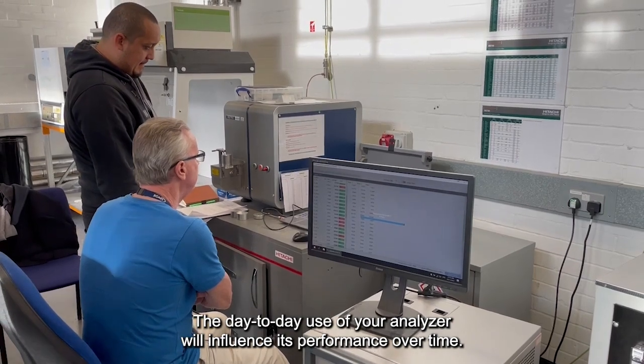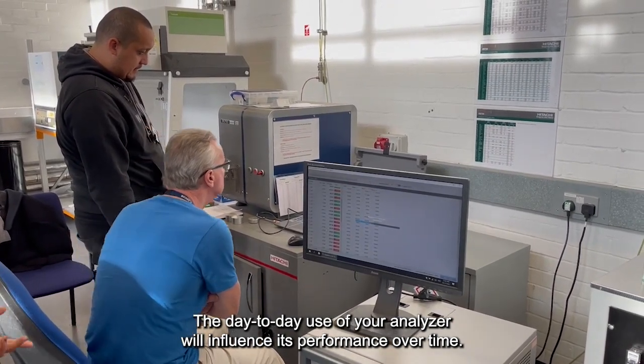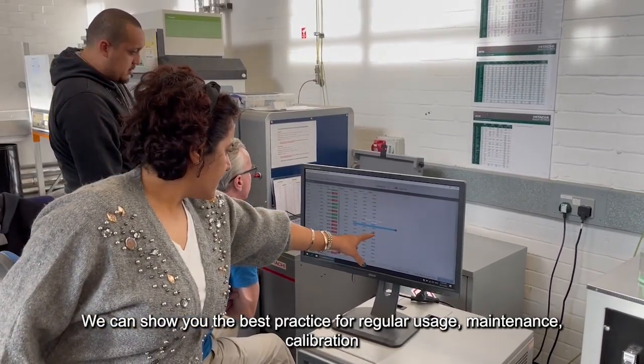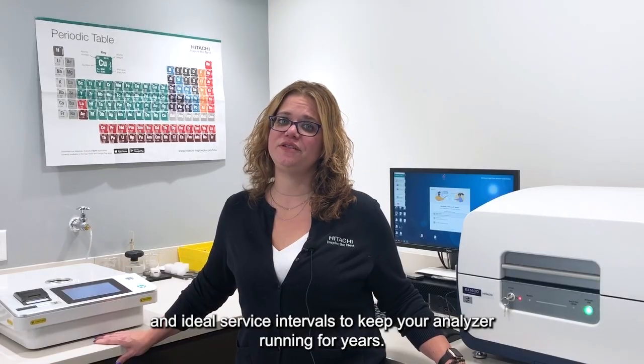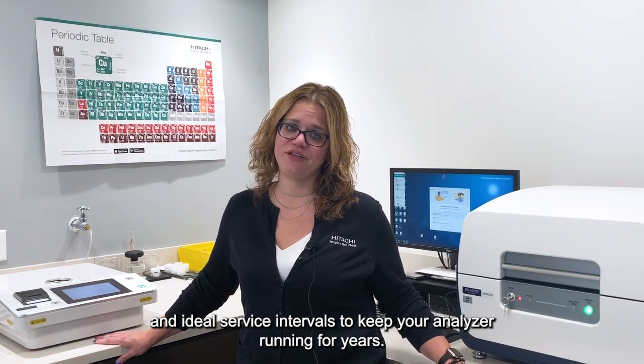The day-to-day use of your analyzer will influence its performance over time. We can show you the best practice for regular usage, maintenance, calibration, and ideal service intervals to keep your analyzer running for years.